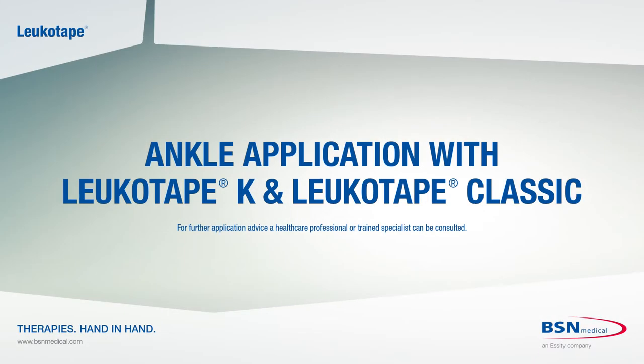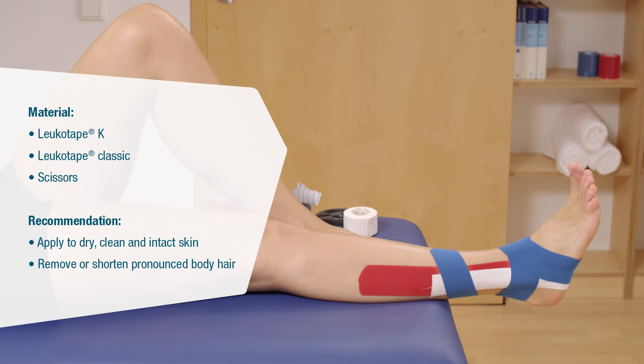The following video shows an example of a combined strapping and kinesio taping technique on the ankle. You will need Leukotape K, Leukotape Classic and scissors.